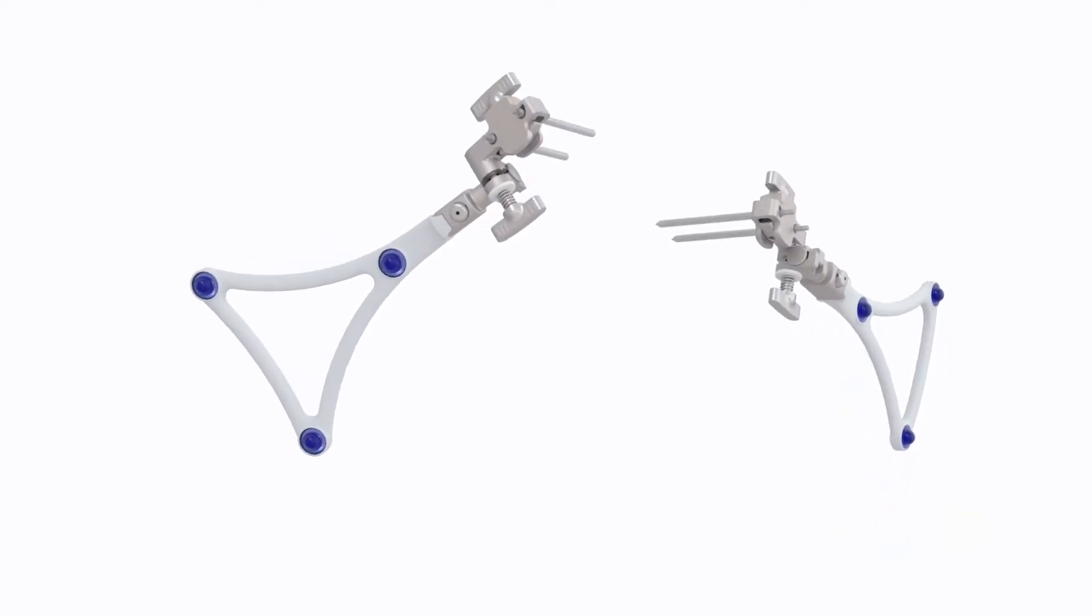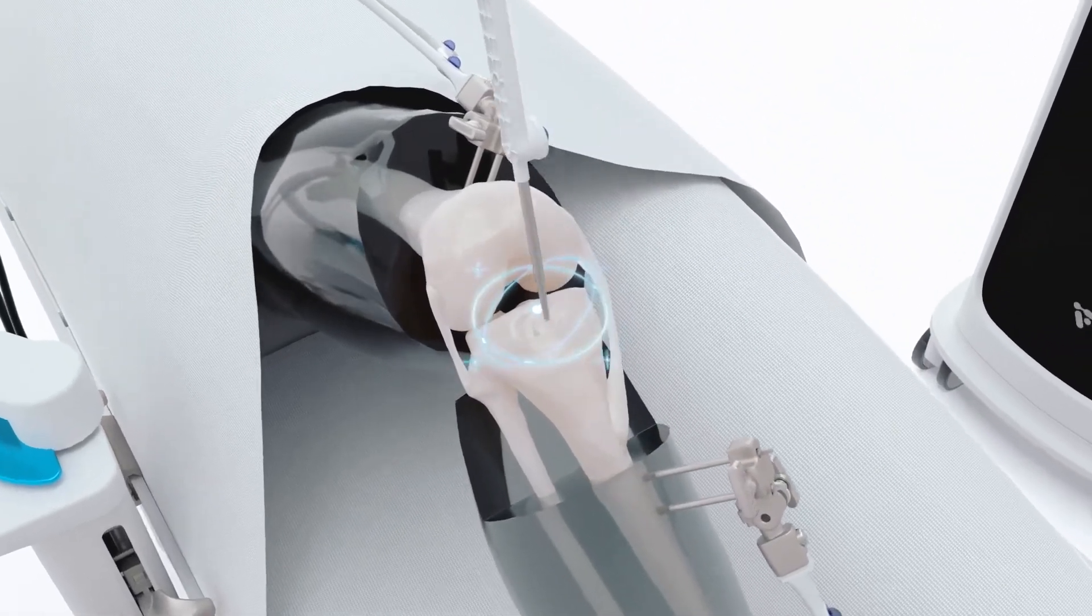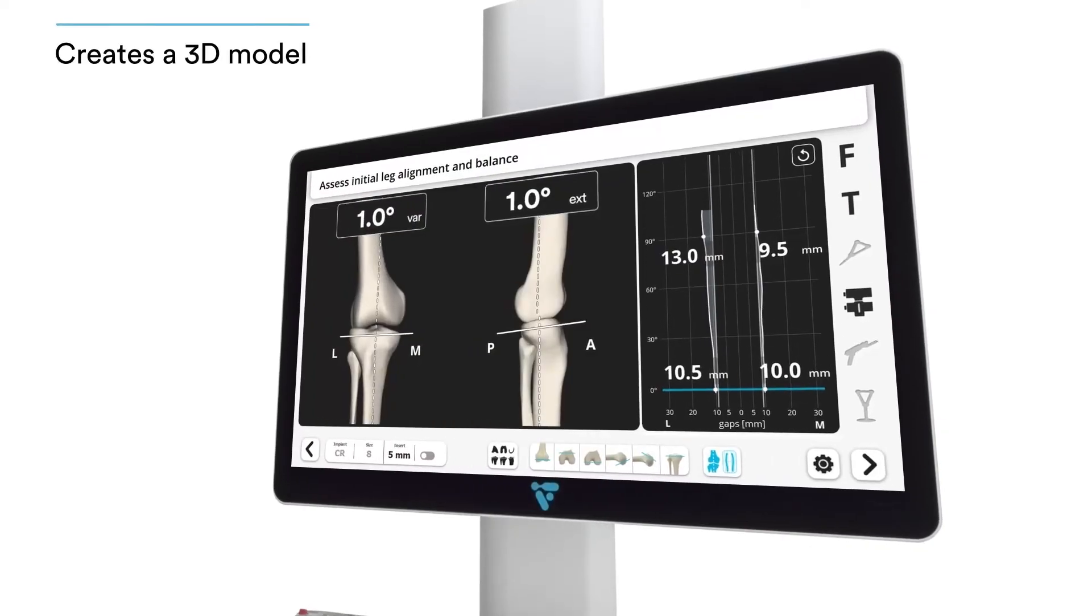Your surgeon will start the procedure by making an incision in your knee. Next, they attach trackers to your knee, which work with the camera to gain the information needed to perform your procedure. From this information, the surgeon creates a 3D model of your knee.